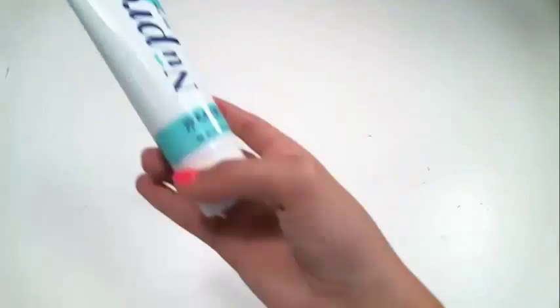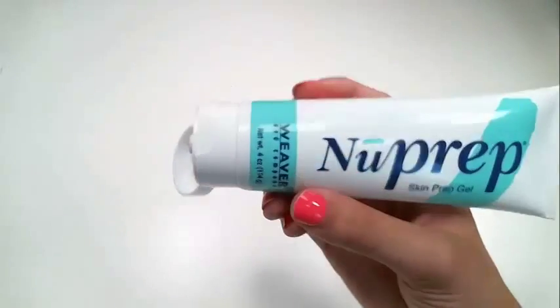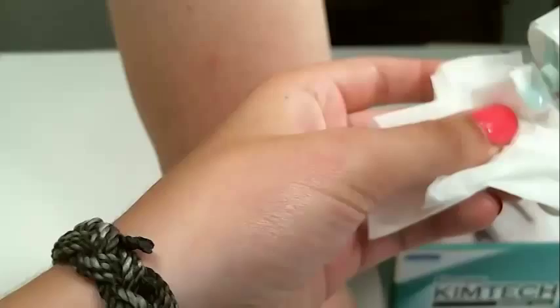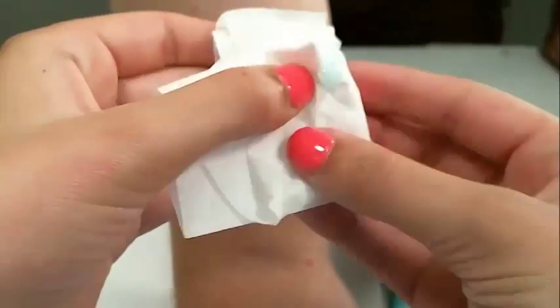NuPrep is an abrasive gel used to remove dead skin cells, oils, and other substances that may be found on the skin. Make sure to gently scrub the skin using a Kimtech wipe until the skin is slightly pink. Any longer than this and you could end up hurting the participant. Not much NuPrep is needed — only a pea-sized drop.